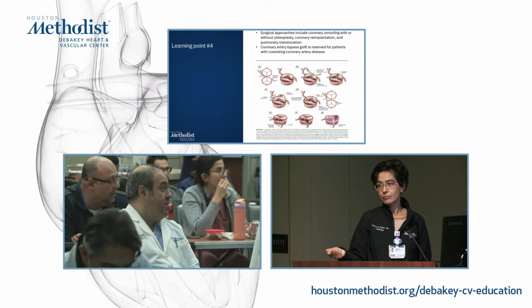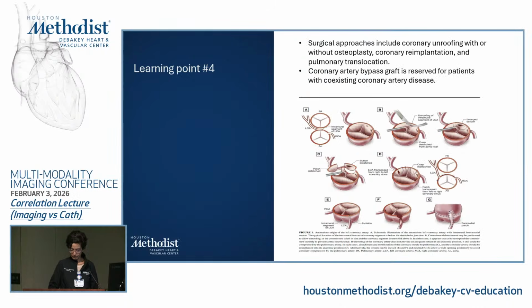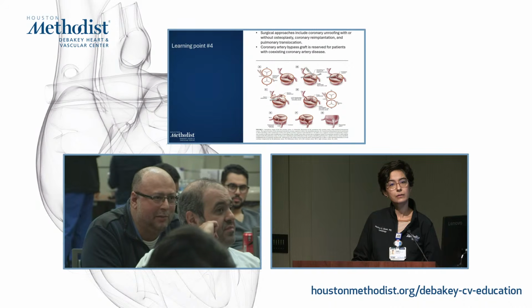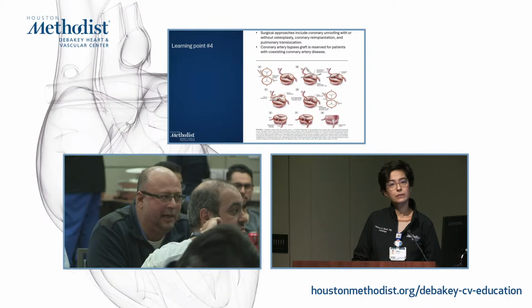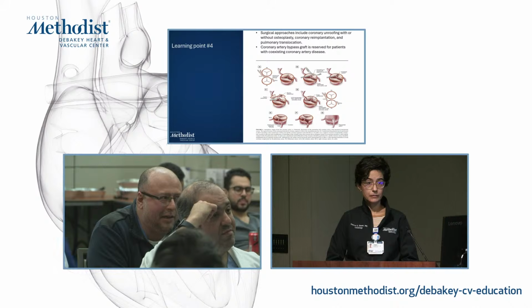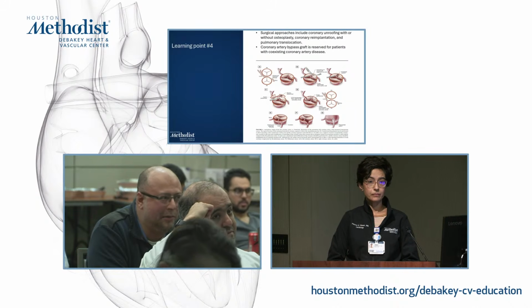I thought the algorithm said ischemic symptoms, which he did have, chest pain, right? Yes, this patient reports chest pain, even playing soccer, every time at 10 minutes. And when he got to the 10 minutes, he dropped his STs. Although we didn't see perfusion defect, it was reproducible at the same time as the pain he gets on the field. He has to go out of the game.